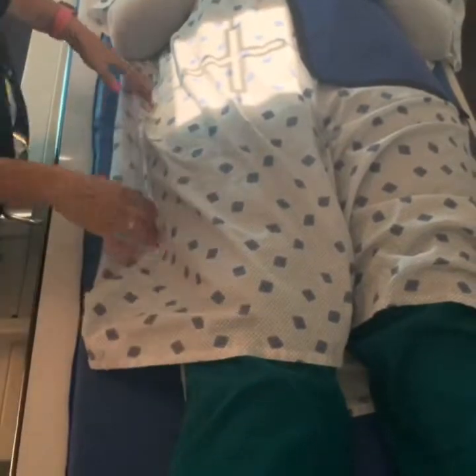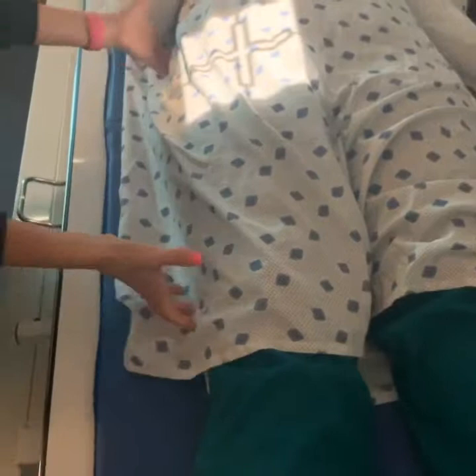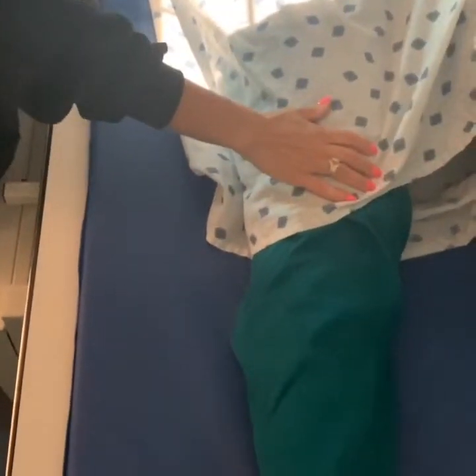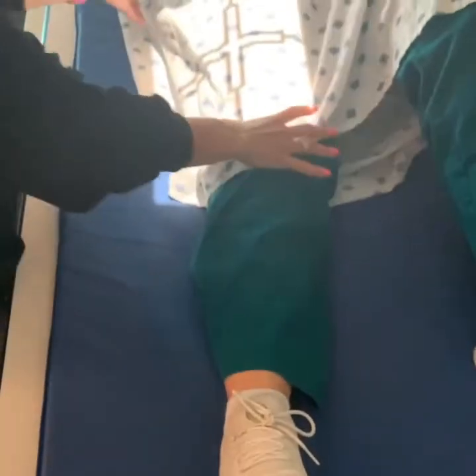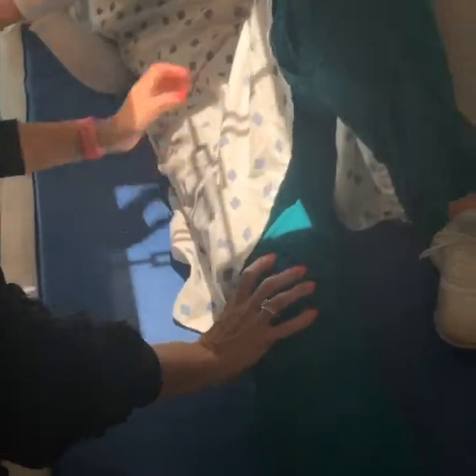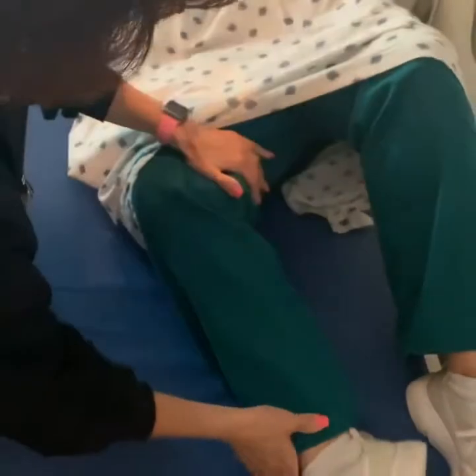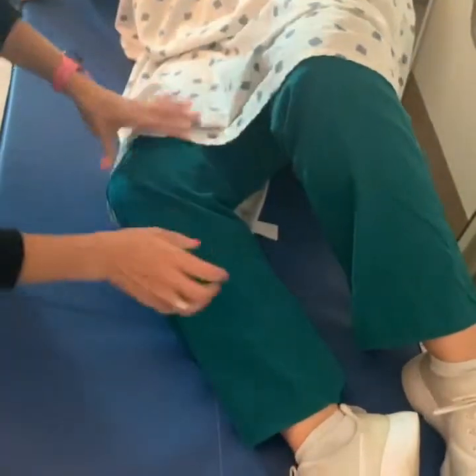Don't look like I was lined up. All right, we'll move that. I think I was a smidge off. Now we're gonna have you scoot away from me a little bit. Good, just like that. I'm gonna open this back up to 17 inches long. I'm gonna move you down on the table. And what you're gonna do is roll up towards me, but keep that leg behind you, good. We're gonna bend this knee. Good, roll your hips more towards me so that you're almost on your side, good.